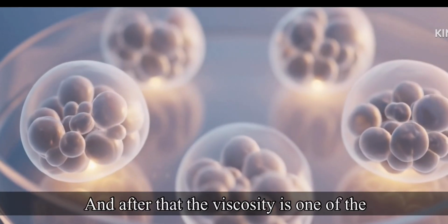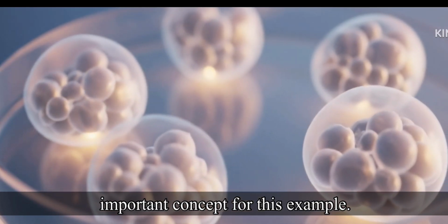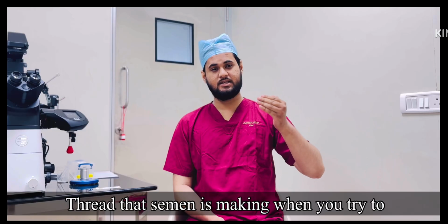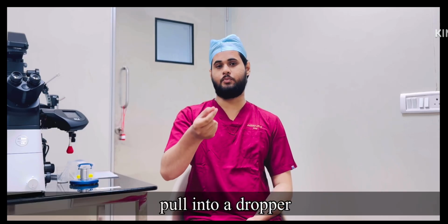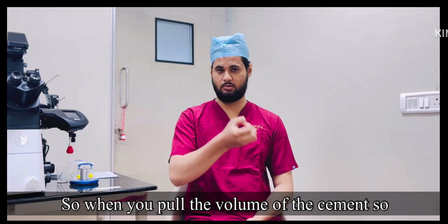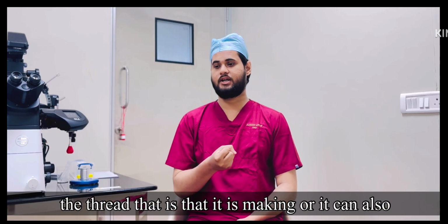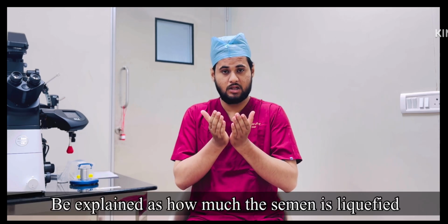After that, viscosity is one of the most important concepts for the semen sample. Viscosity is basically the thread that semen makes when you try to pull it into a dropper. It can also be explained as how much the semen is liquefied.